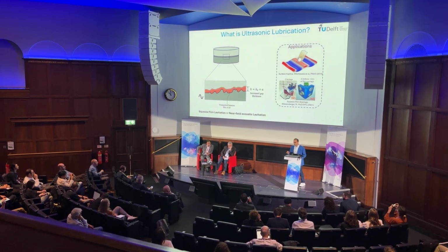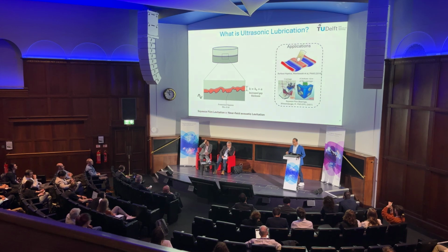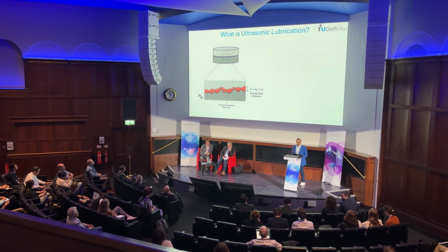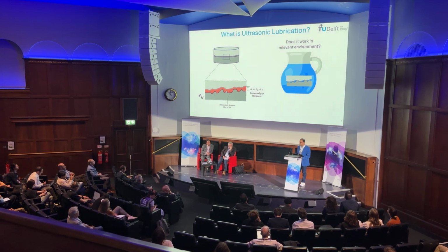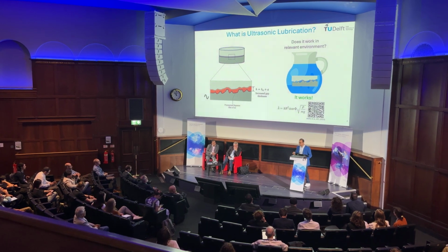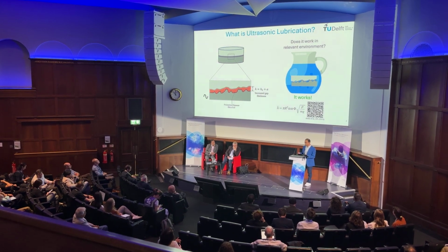One thing that you realize when you look at these applications quickly is that they are all working in air-dry environments, which is far from the actual environment of a catheter. So one of the very early questions that we asked is, okay, what if we take this vibratory system and place it into a liquid environment with a viscoelastic interface? Will it still work or not? And the answer we got is that it actually works, and we derived the law that predicts the separation between the two surfaces given the vibration amplitude, frequency, and the fluid properties.